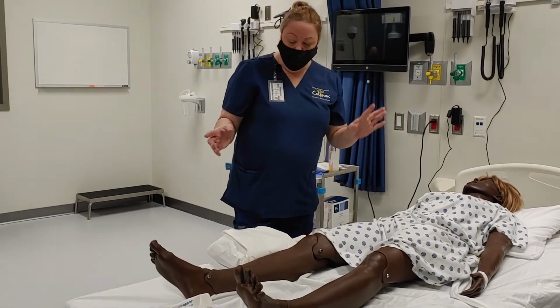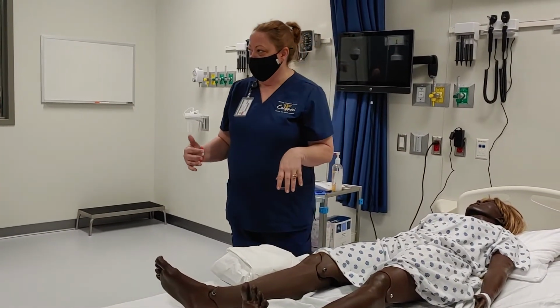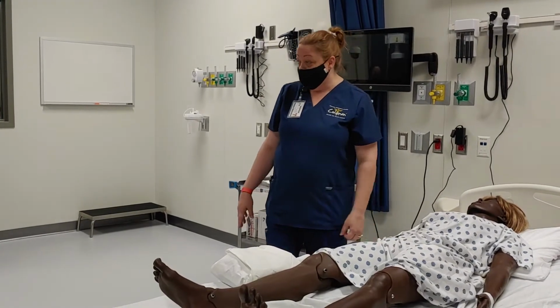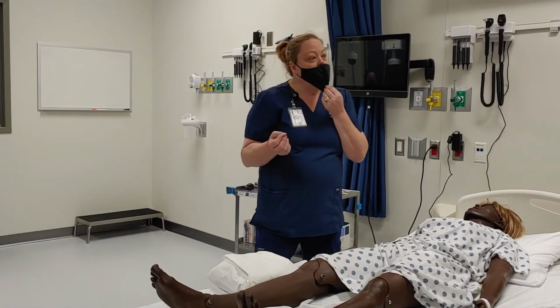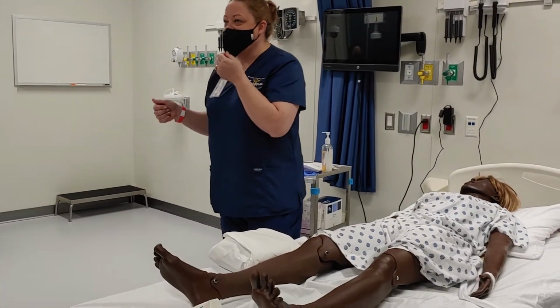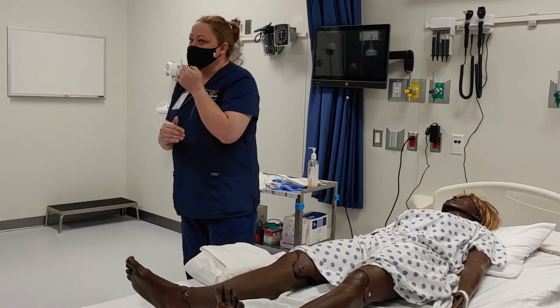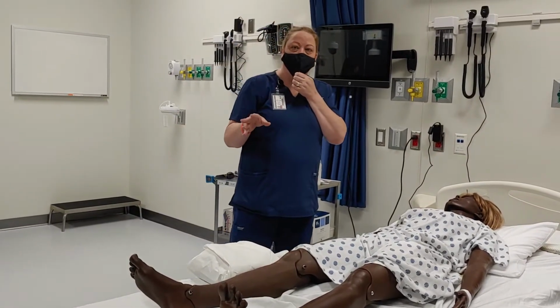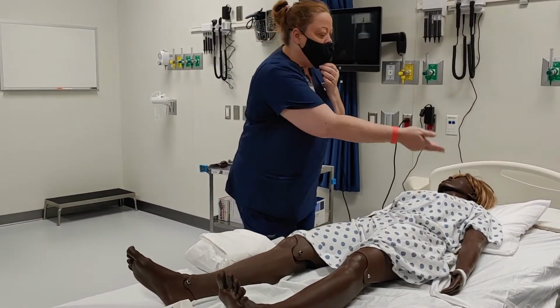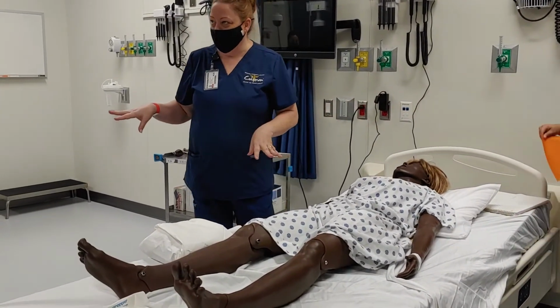So once we've done that, we need to get the patient in a good position for us. Now, I obviously need to have the rail down that's closest to me. Typically, you're going to do this on which side of the patient that you're dominant. I'm right dominant, so it is going to be best for me to stand on the right side, and you'll understand why here in a few minutes. It all has to do with how you hold and everything. But the other rail I would want up, but I'm just going to leave it down so you guys can see a bit better. Okay?